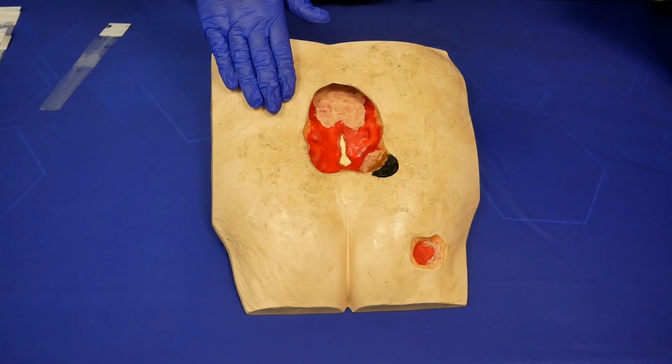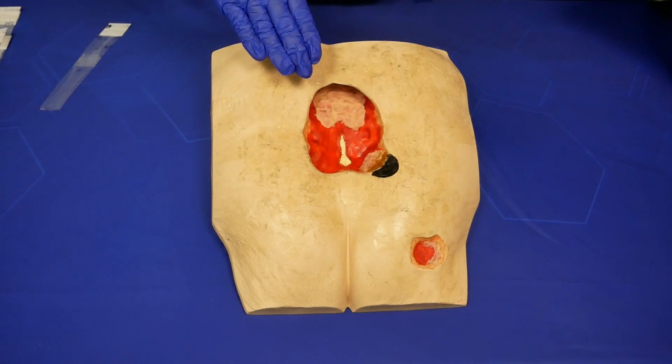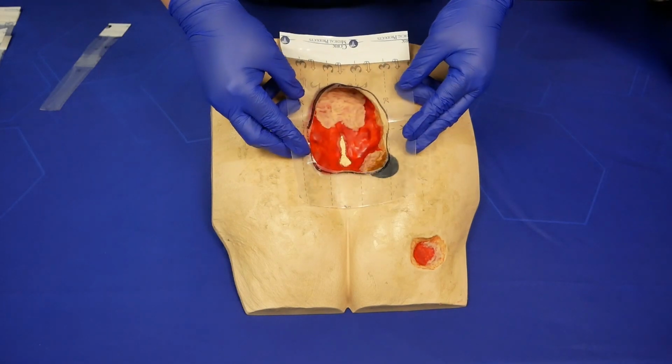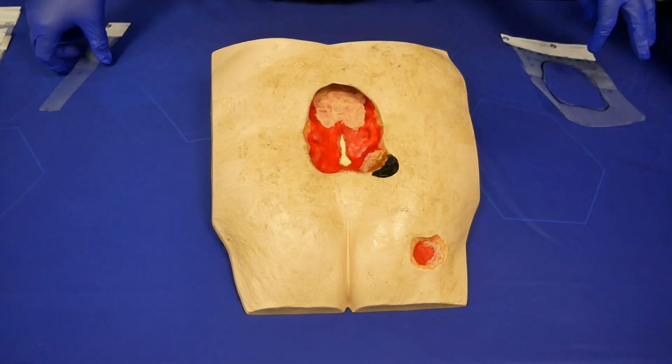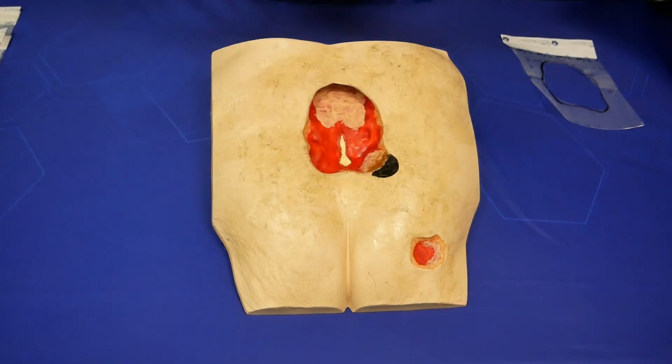To protect the good skin of the peri-wound, we've already applied that skin prep like we said before. Now we are going to window pane with drape. And there's a couple different ways you can do it. You can do a pattern, or you can do strips and work your way around that peri-wound to protect the good skin from the black foam.